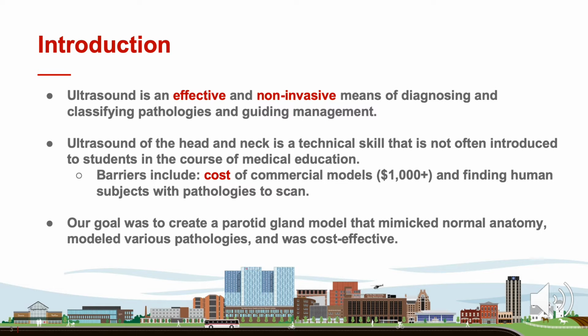Our goal with this project was to create a parotid gland model that mimicked normal anatomy, modeled various pathologies, and was cost effective, most importantly.